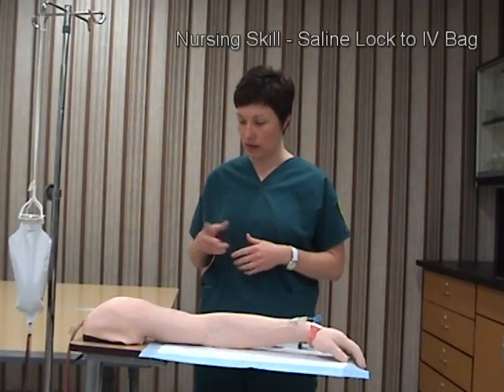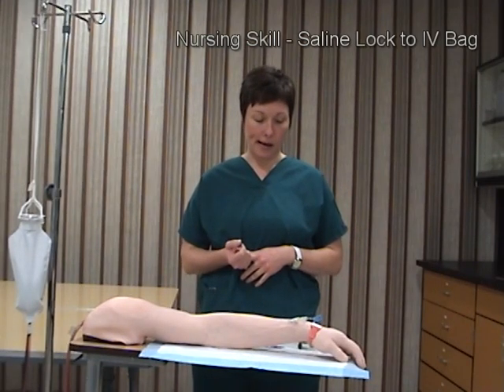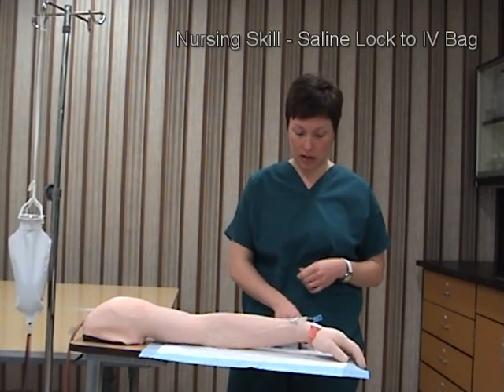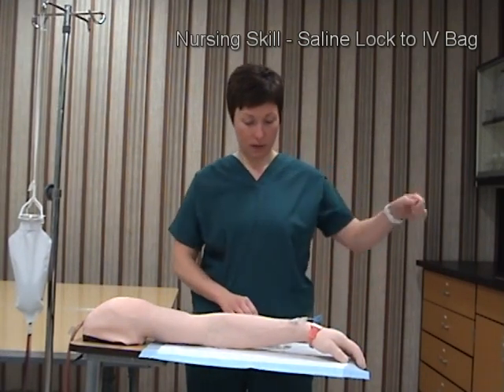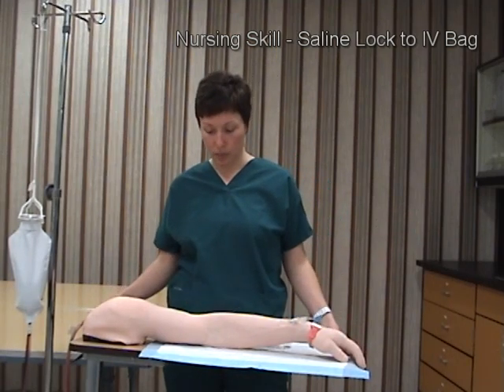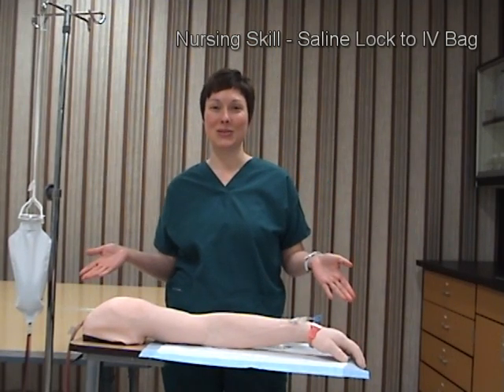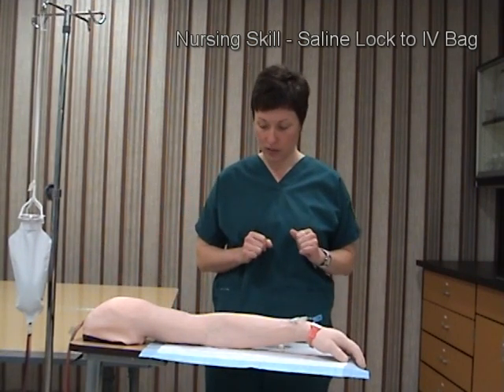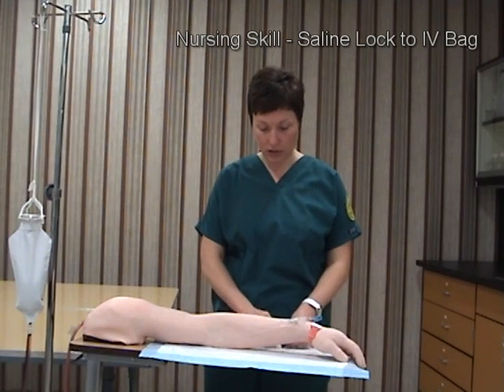I will come in, introduce myself to the patient, explain my procedure, and tell the patient my name. I'll provide for patient privacy throughout the whole procedure, and if I had a real patient I'd raise the bed up to my working level so that I'm maintaining proper posture.